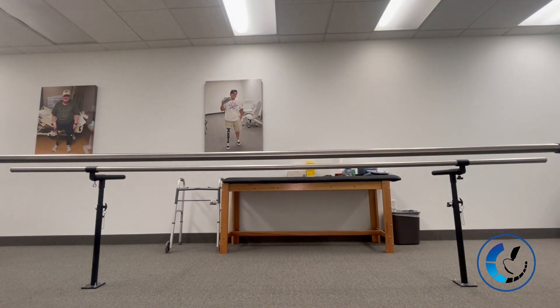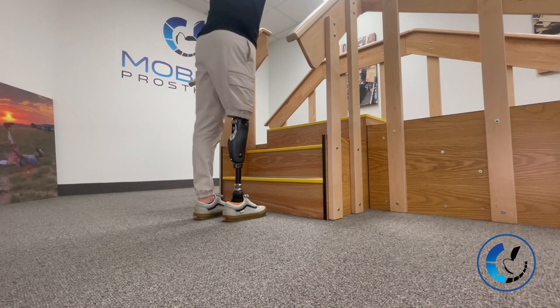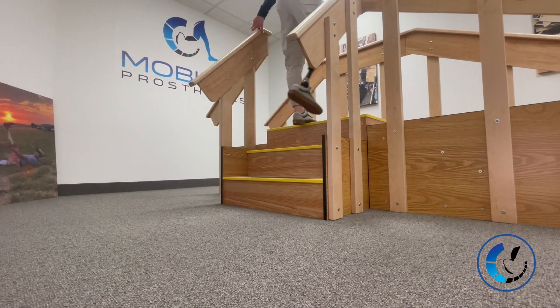Here's the quick walk-to-run. I'm not great at it, but the knee does do walk-to-run, and that's a nice added feature.